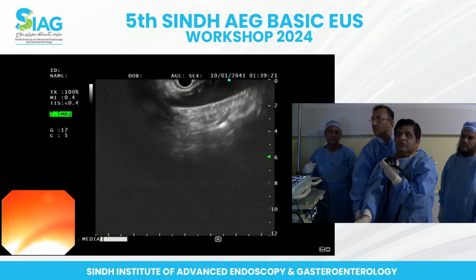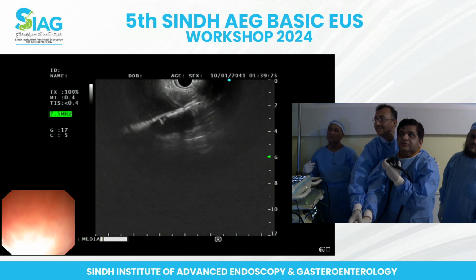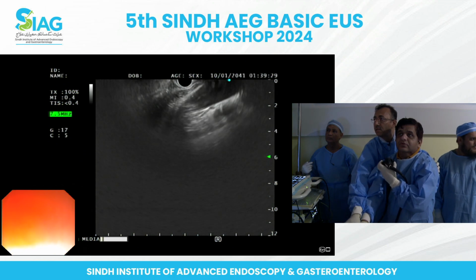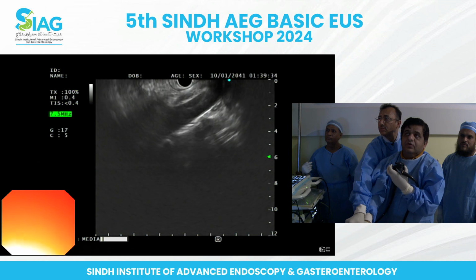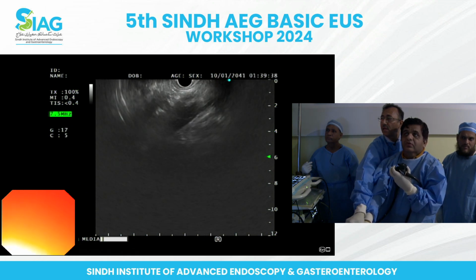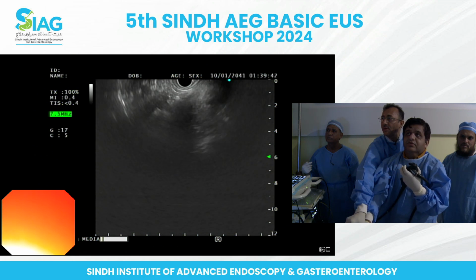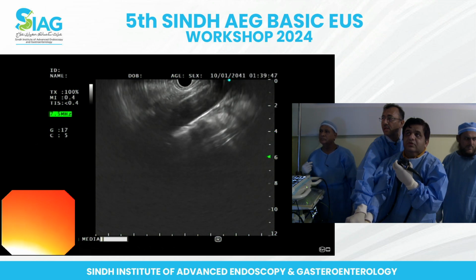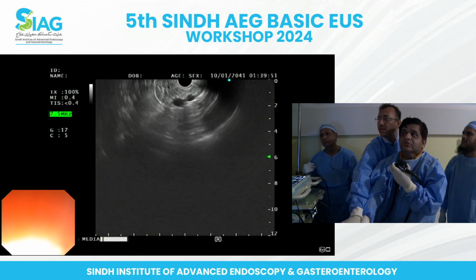Now keep it under your transducer, okay. Now slide gently along this black thing, and keep it under your transducer. You need to keep it under your transducer, push, and the first vessel which is arising from this, that is the celiac artery. Okay. So once from the big aorta, once you've seen the celiac artery, follow the celiac artery a little further, and you're going to land at the pancreas.